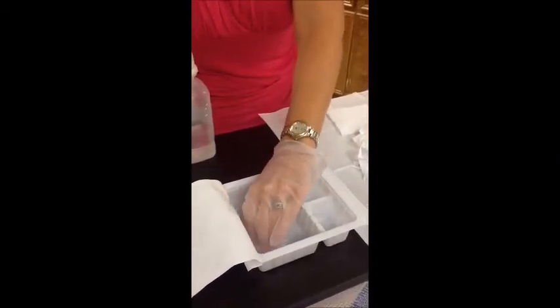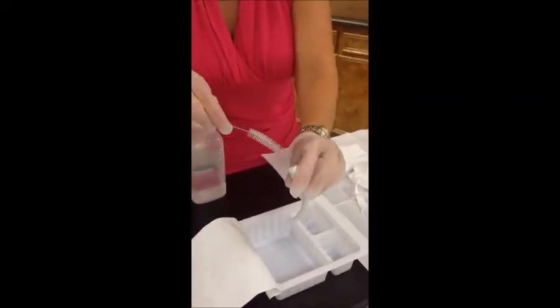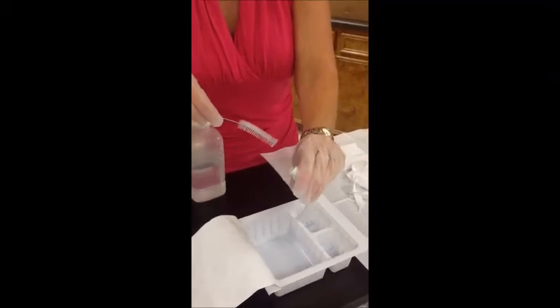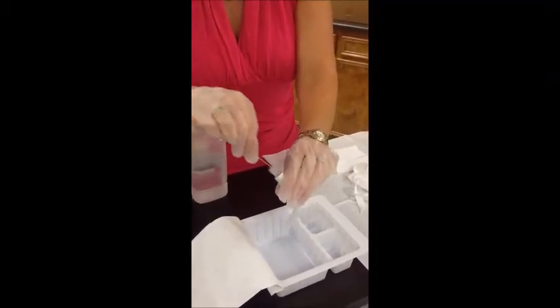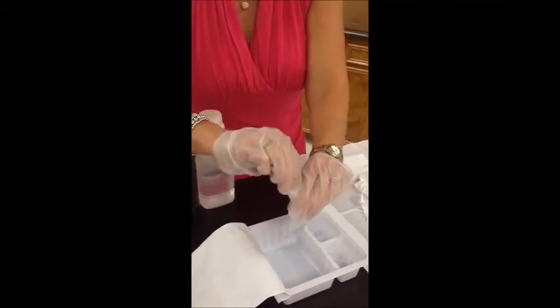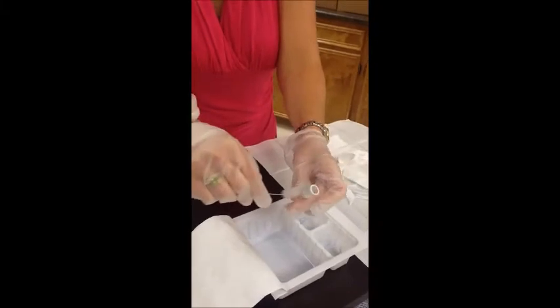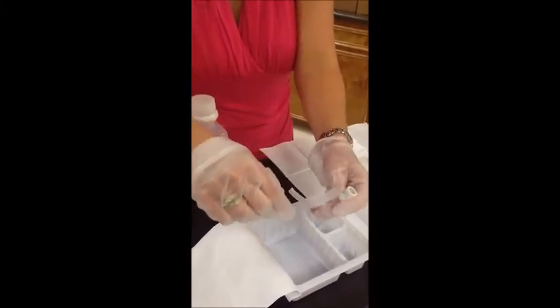So I come in here and you're going to think, well, she's contaminated that hand. And that is true because I'm touching a nasty inner cannula. But it's the patient's bacteria and it's their secretions. So my hands were not contaminated. This inner cannula is, but it's with the patient's own bacteria, and that's acceptable.